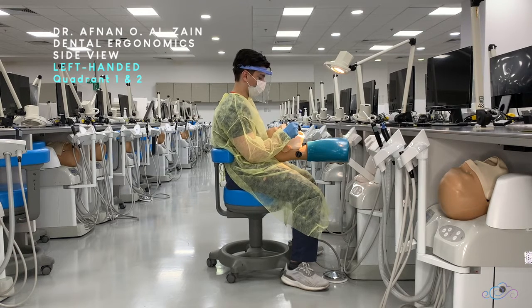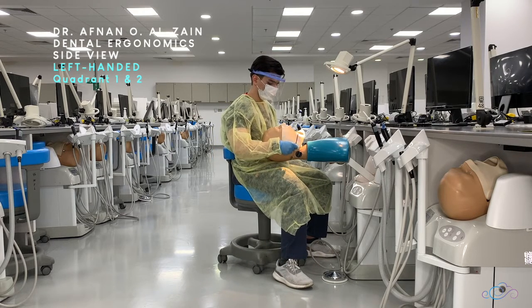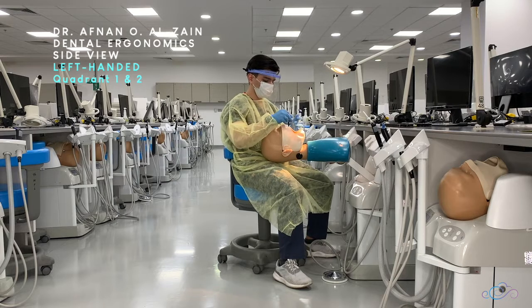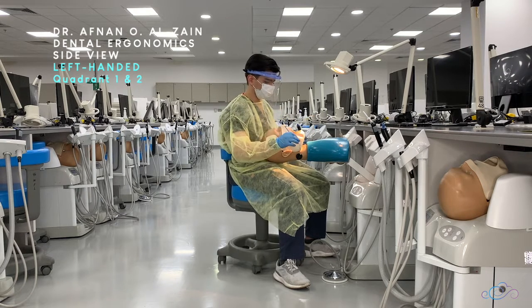When working on the labial surfaces or the buccal surfaces, you're going to use direct vision. When working on the buccal surfaces of quadrant two, you can tilt the patient's head towards the right side so you can clearly see the buccal surfaces from the left side. You can sit either behind the patient or at the left rear.